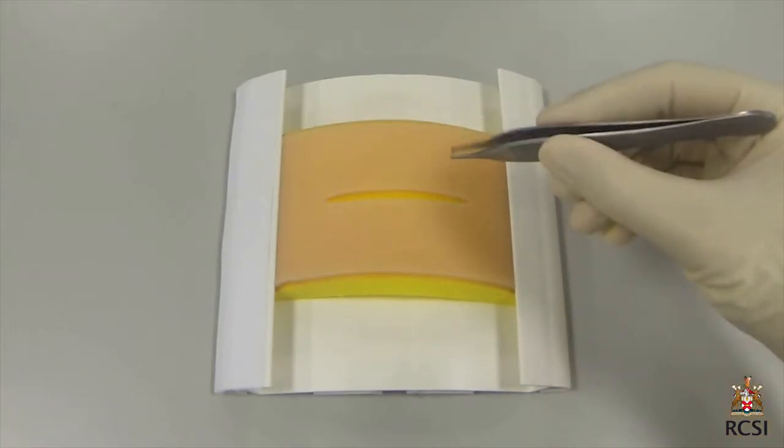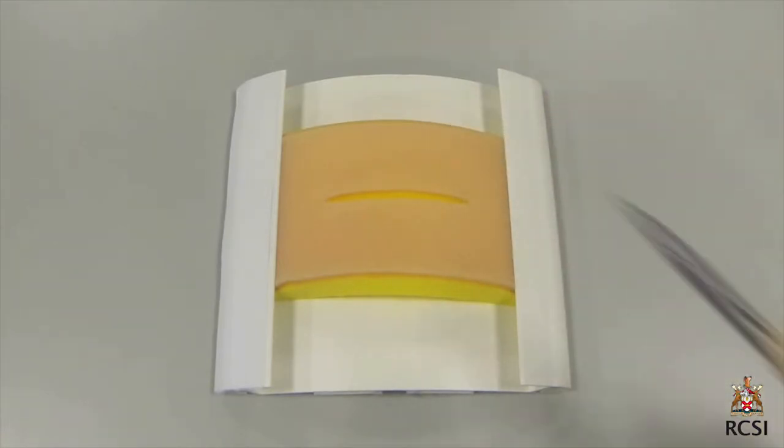This video demonstrates how to close a wound with interrupted sutures tied with an instrument tie.